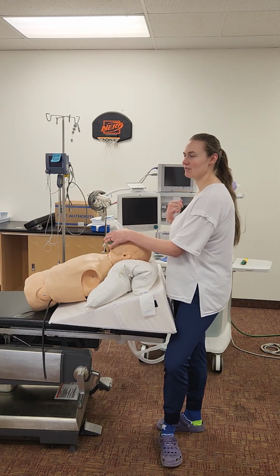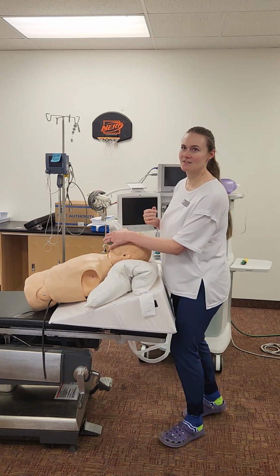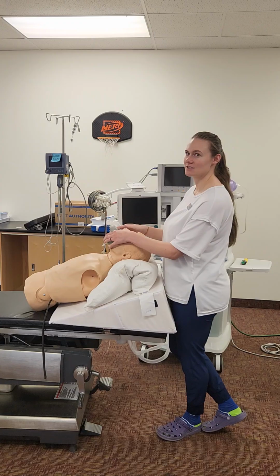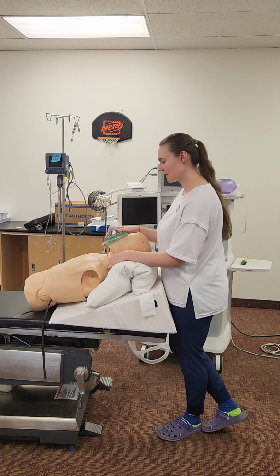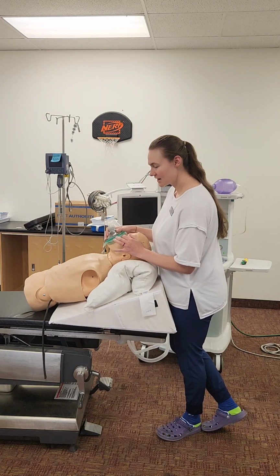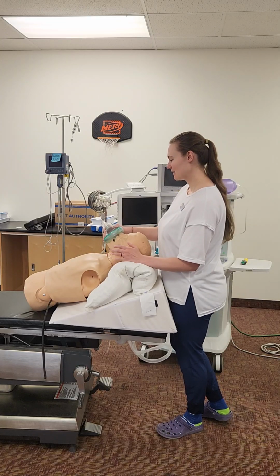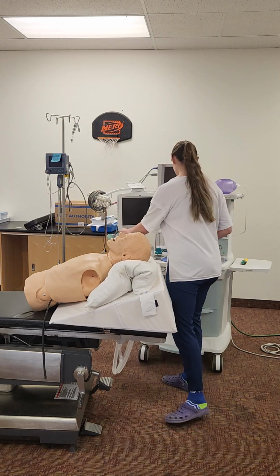So I'll push my fentanyl, I'll wait 2 to 3 minutes, and then I'll use my lidocaine, 1 to 2 minutes, and then I'll use my propofol and intubate once they're in stage 3, so I can check my lid reflexes. I can open his eyes and see where those are at, and then once those are in and I feel happy, then I can start my intubation.